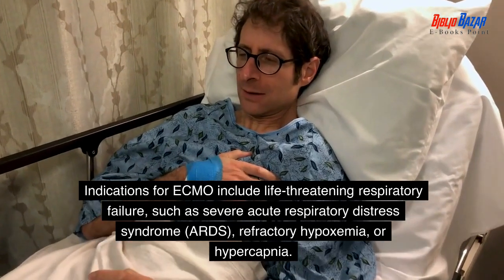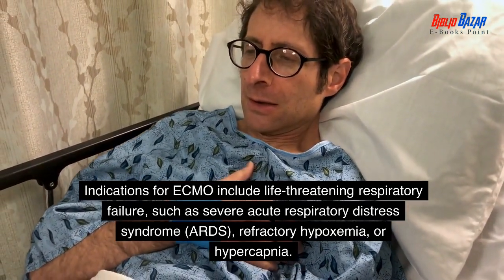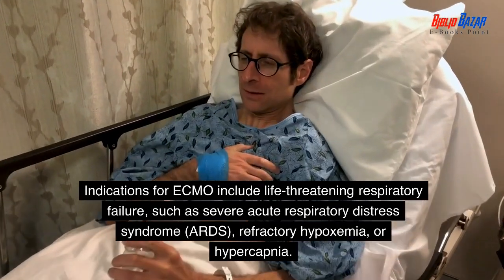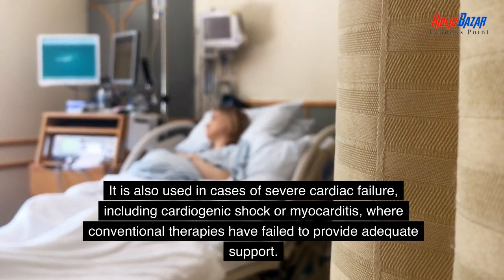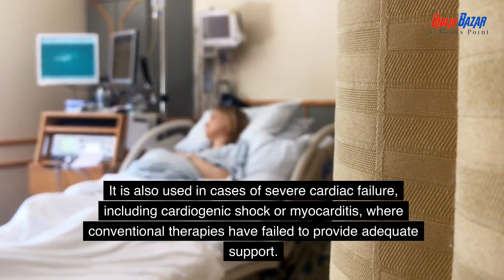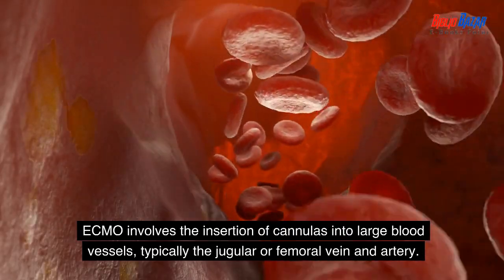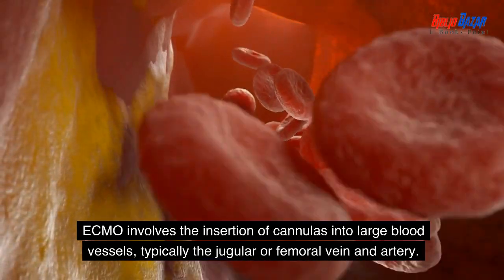Indications for ECMO include life-threatening respiratory failure, such as severe acute respiratory distress syndrome, ARDS, refractory hypoxemia, or hypercapnia. It is also used in cases of severe cardiac failure, including cardiogenic shock or myocarditis, where conventional therapies have failed to provide adequate support.